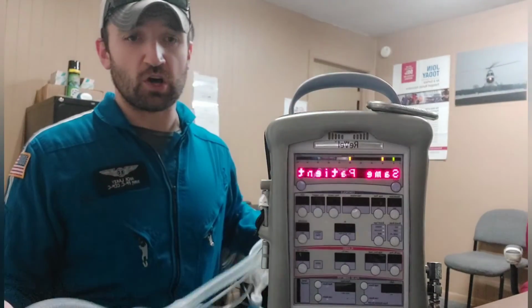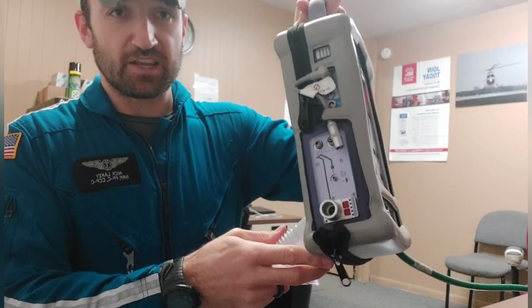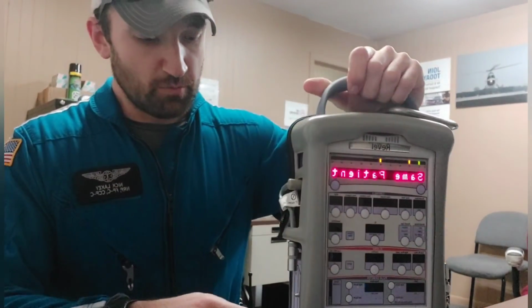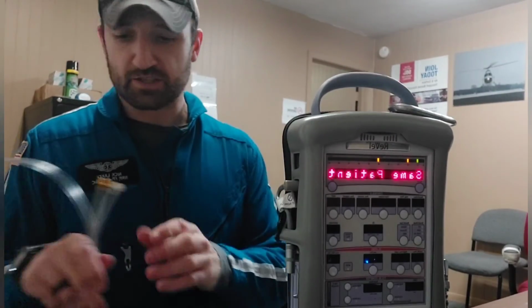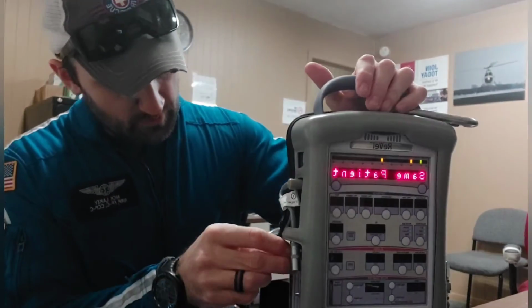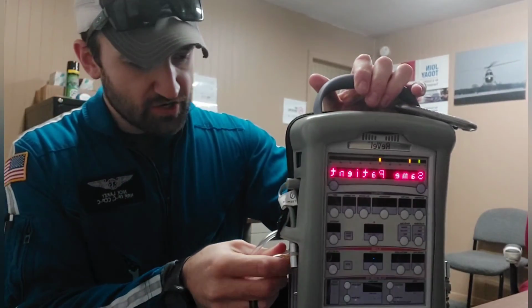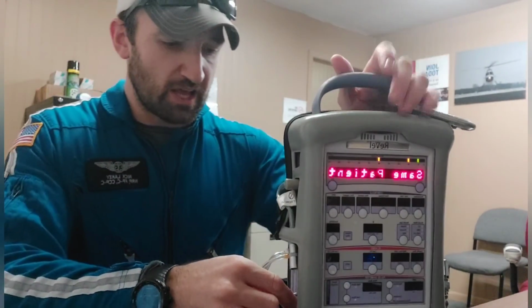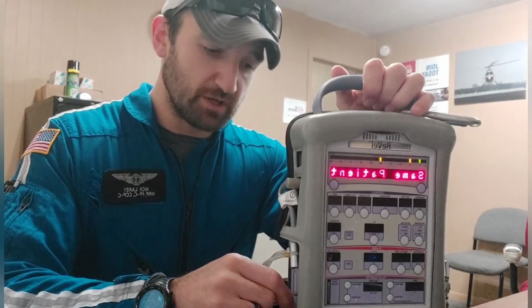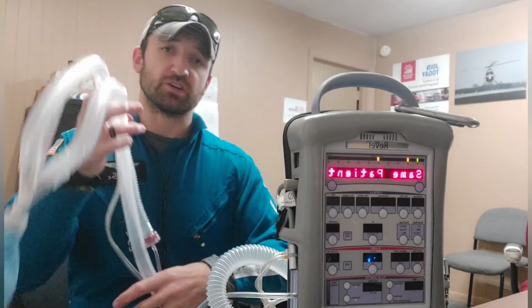It's basically just a long section of hose, and we're going to plug that into the side of the ventilator. You see there's a couple little ports here on the side. I'm going to plug it in. There's a couple smaller connectors that we use as a flow sensor, and they can give us pressure sensor feedback as well as blend oxygen to the circuit where the patient's going to receive it. Okay, so we've got that hooked up to the ventilator circuit.